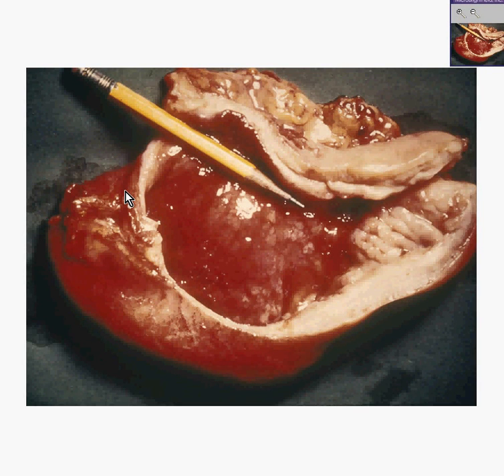Here's another case. It's called adenocarcinoma stomach, linitis plastica. Like any other adenocarcinoma of the stomach, which of course starts along the mucosal aspect and may form a big bulky tumor, the main growth pattern of a linitis plastica, defined as poorly differentiated but diffusely infiltrating adenocarcinoma throughout all the layers of the stomach, gives the stomach an appearance that the wall is very diffusely thickened. There may or may not be much evidence left of a mucosal tumor.